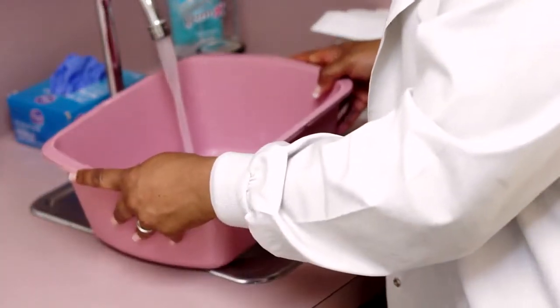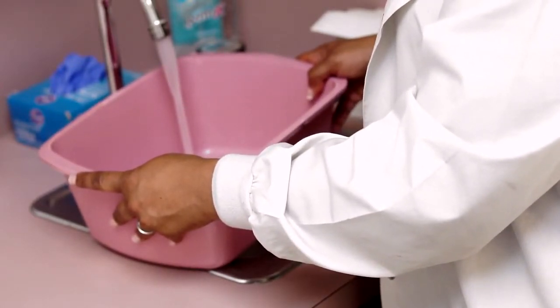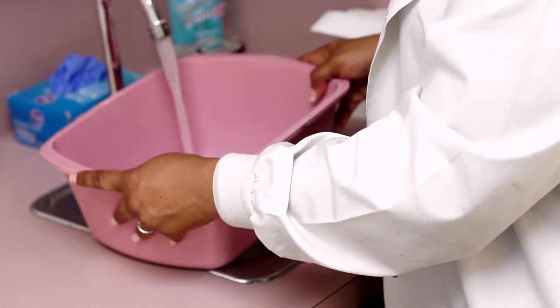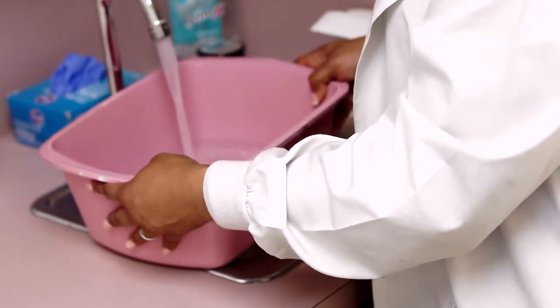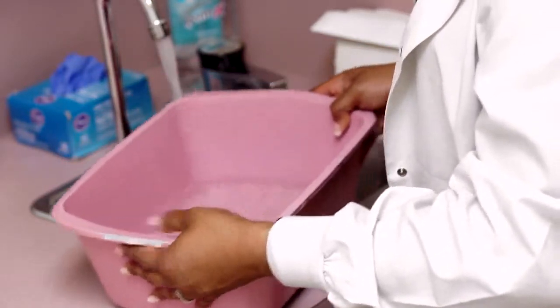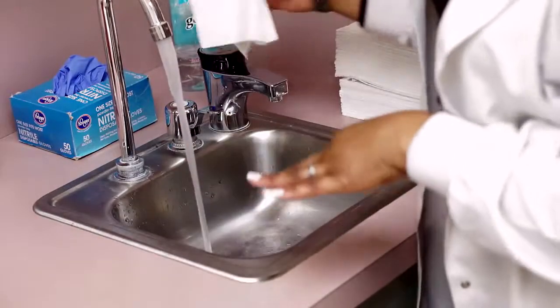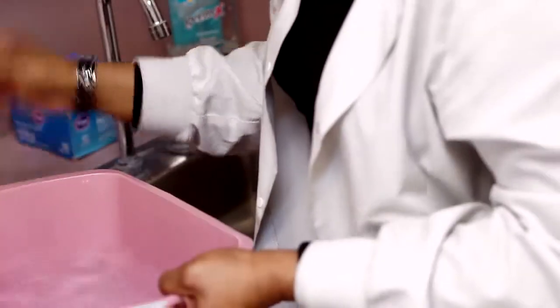We go ahead and fill the water, fill the bucket up. You don't have to put a whole lot, maybe about halfway. For testing purposes, we can go a little bit less than that. We want to make sure we have enough water to wash as well as rinse. Okay, once we have enough water, go ahead and pull the bucket out. You want to grab a paper towel. You want to turn the water off. The faucet is considered contaminated, so go ahead and just turn that off. Throw that away. And then we go ahead and walk back over to the bedside, and don't forget your soap.